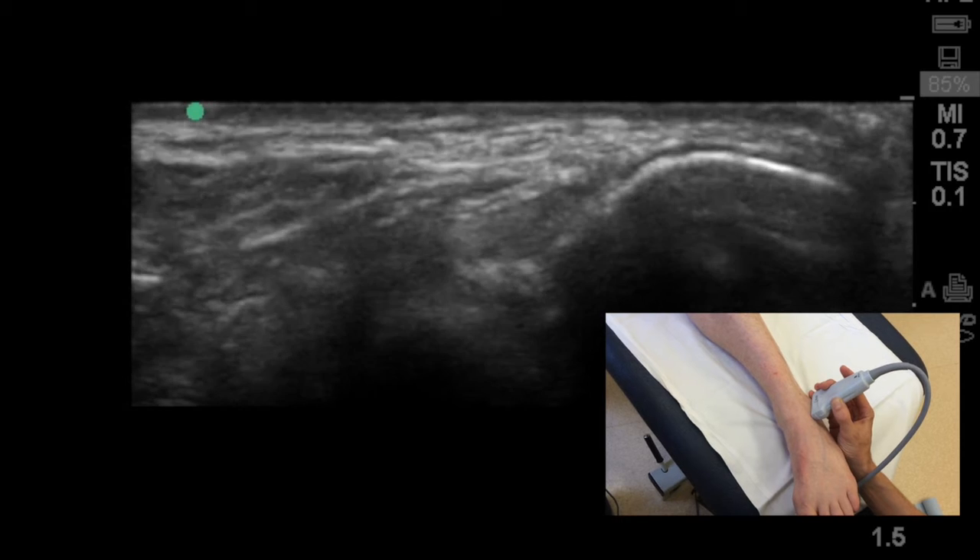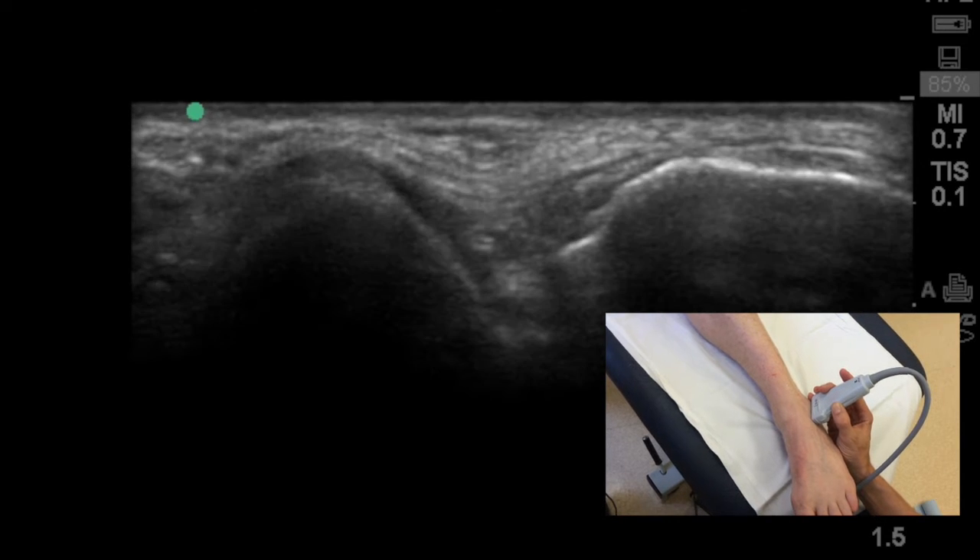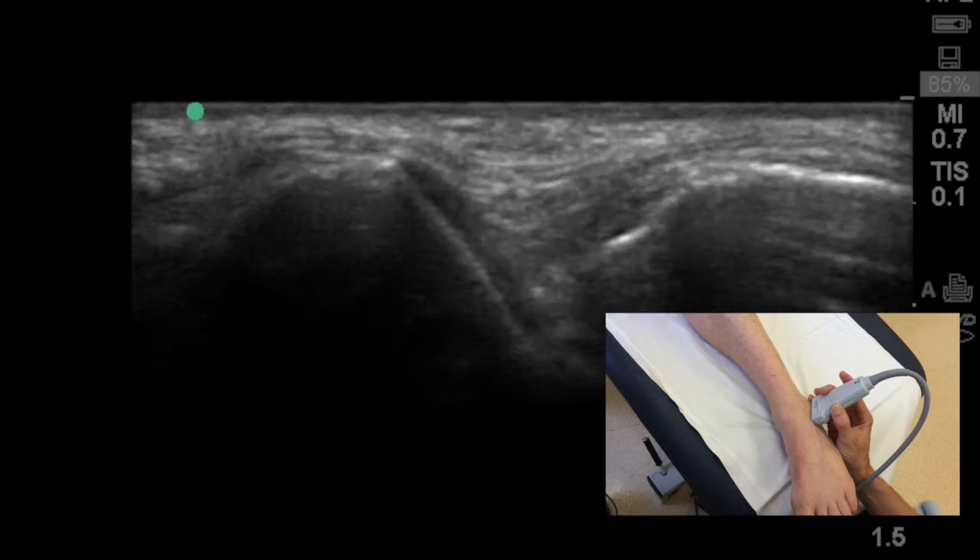Tracking your probe distally, keeping those bones in a cross-sectional view or short axis view, you'll start to see the tibia disappear and the talus start to emerge.